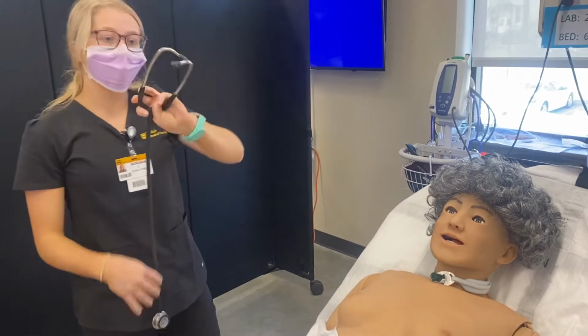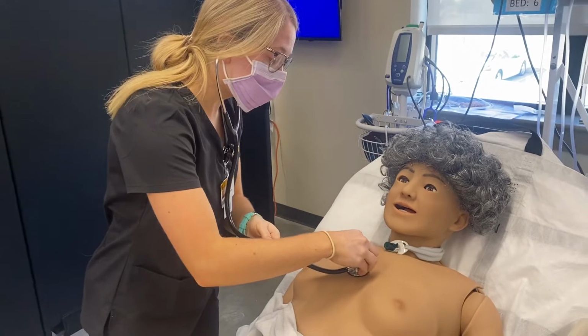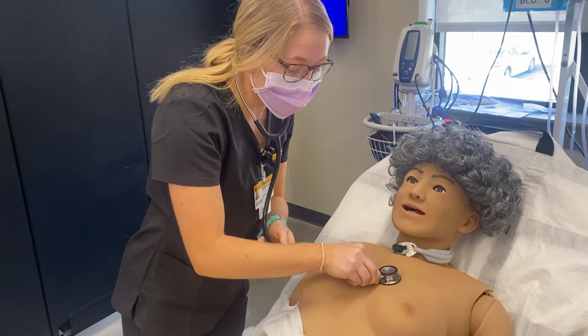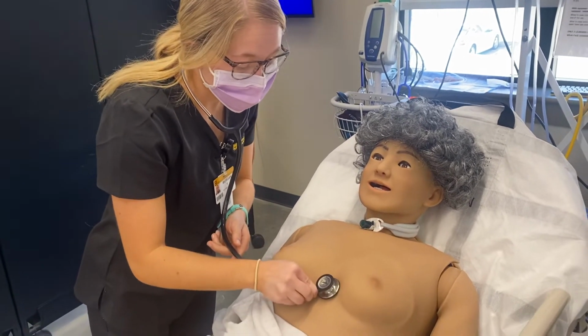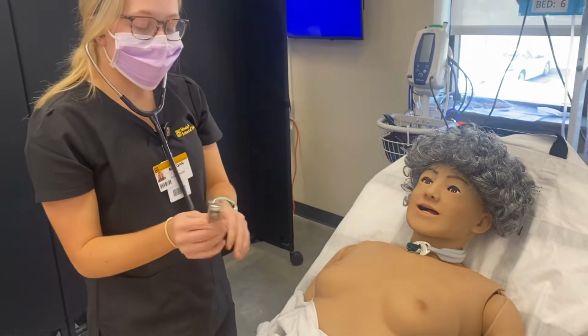Now I'm going to listen at the 5 different spots here. I'm going to feel for abnormal pulsations. No thrills or heaves. Listen to the chest. Then I'm going to do the same spots but with the bell.